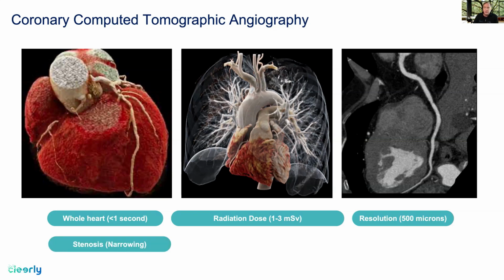In the first few years cardiac CT was around, we were all very focused on looking at stenosis and repeating what we were already able to do with invasive angiography. And then for a few years, many people pivoted to trying to see if we could use coronary CT to define the presence of ischemia as we do with other stress tests.